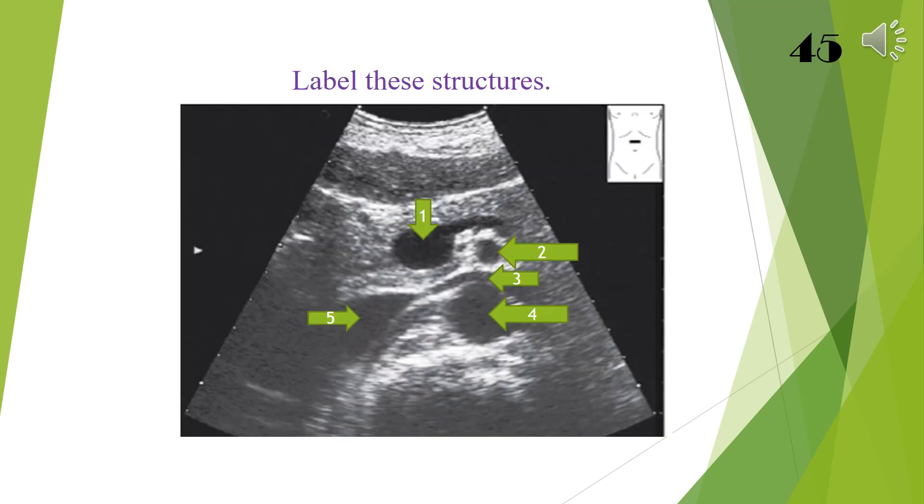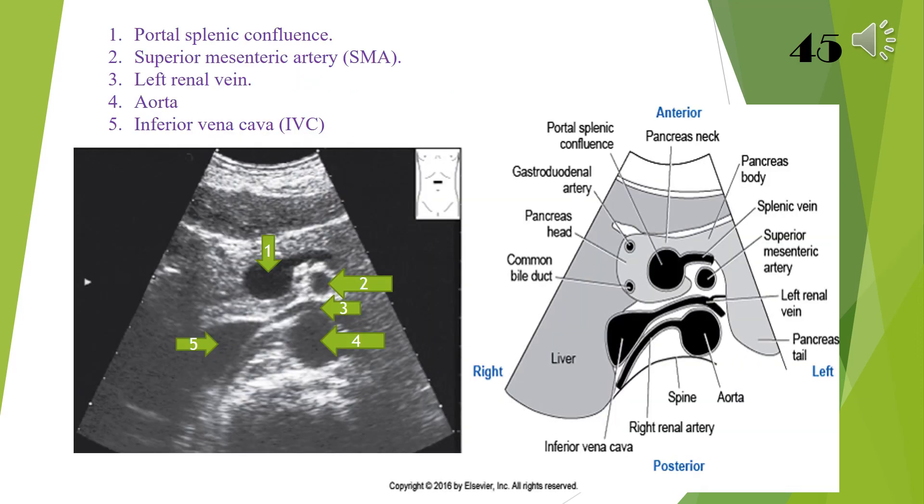Label these structures: 1 portal splenic confluence, 2 superior mesenteric artery SMA, 3 left renal vein, 4 aorta, 5 inferior vena cava IVC.